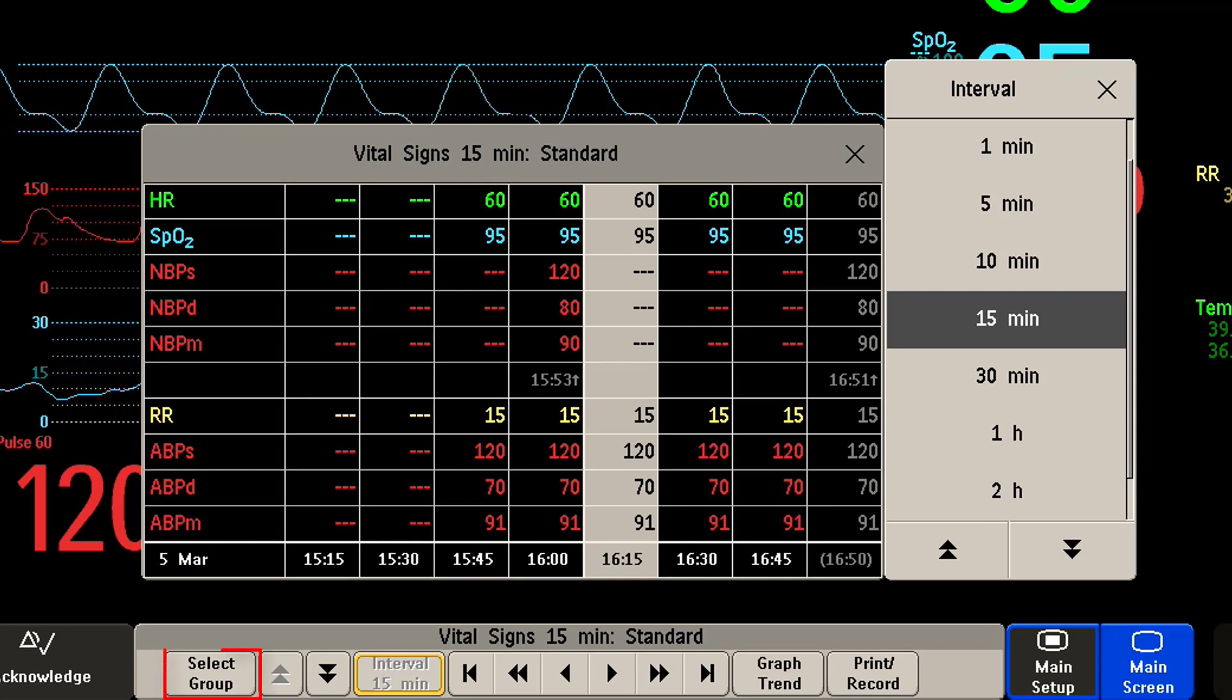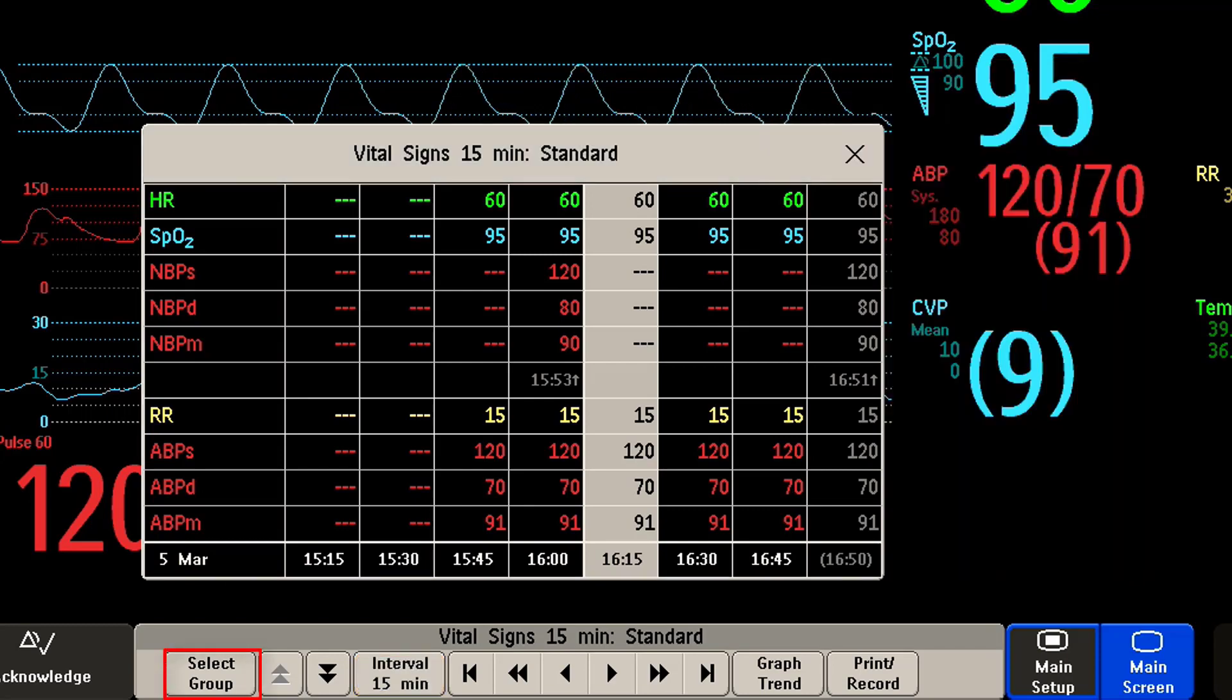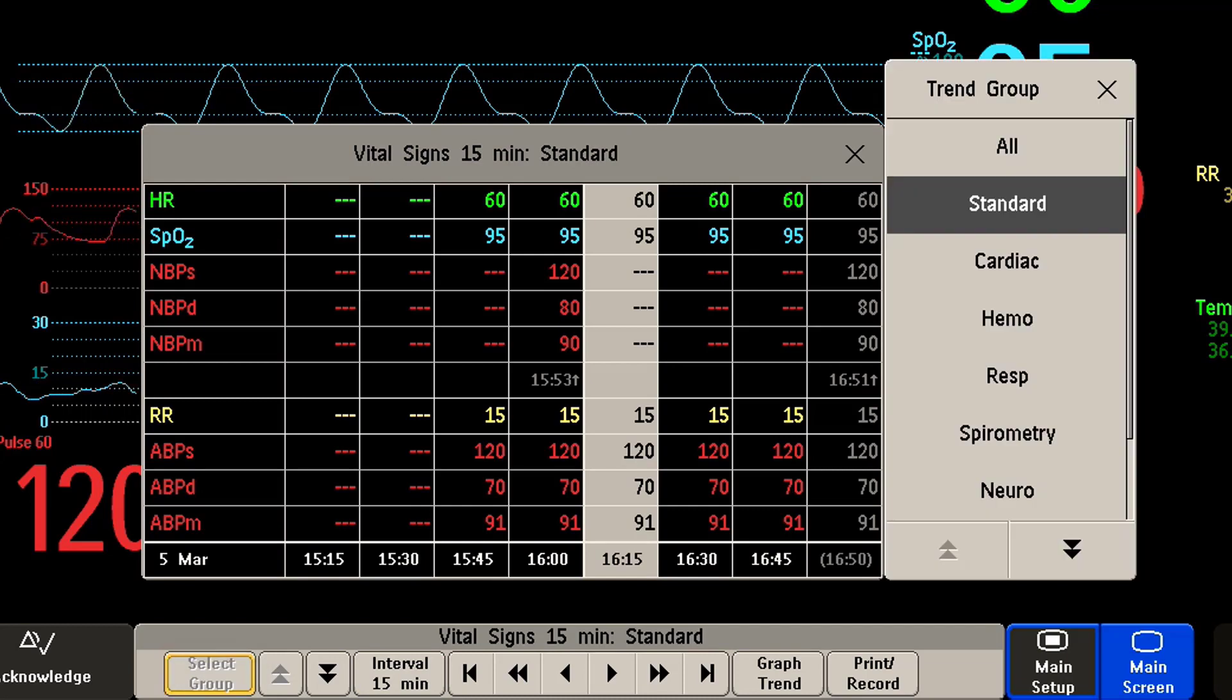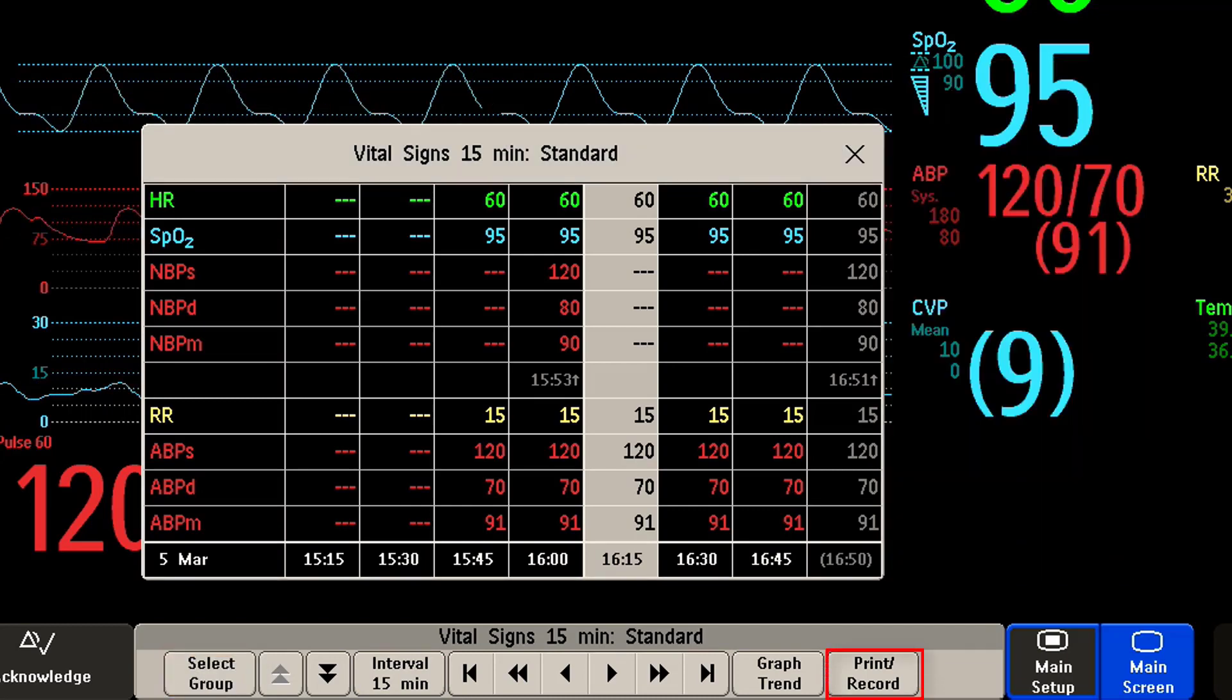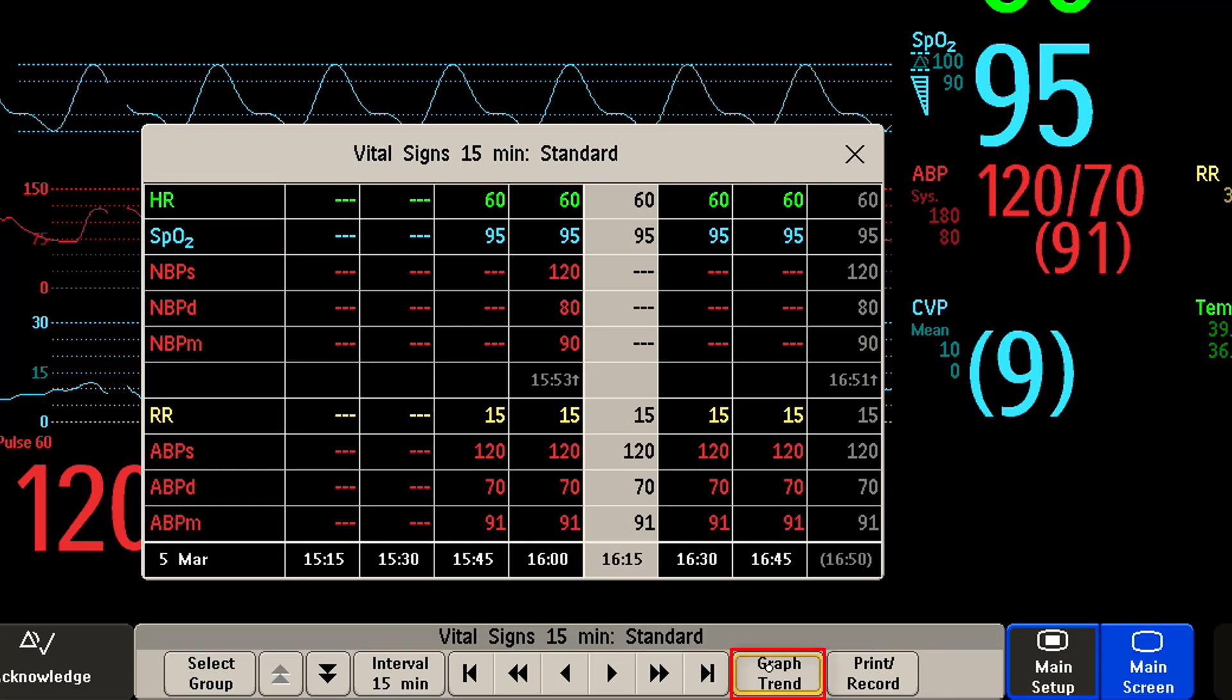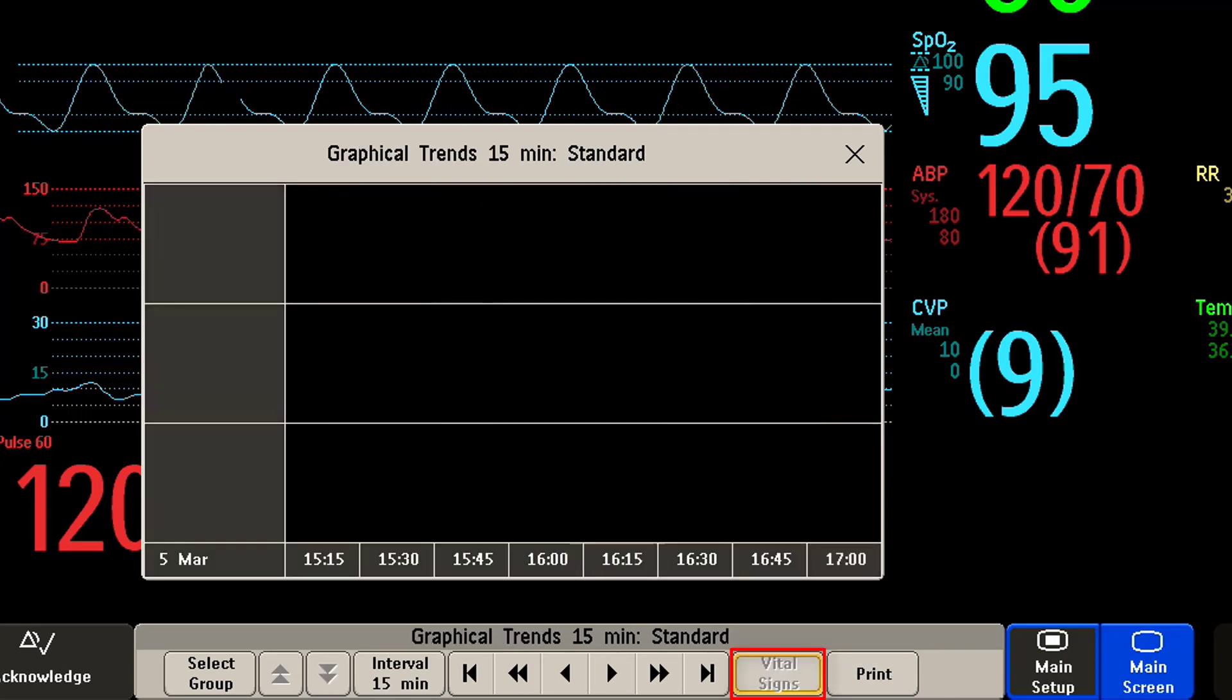I can select a trend group from a list to view specific measurements, print a trend report, and switch this view to a graphical trends view and return back.